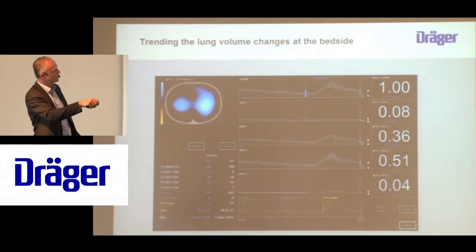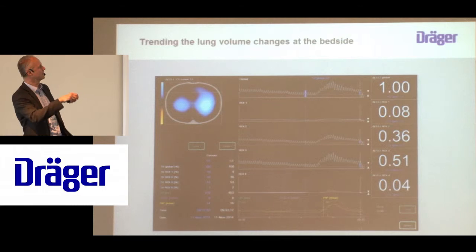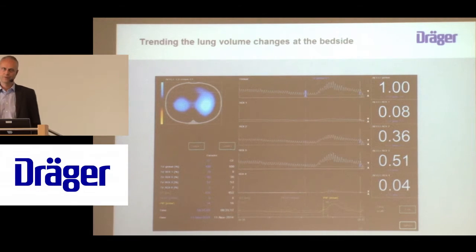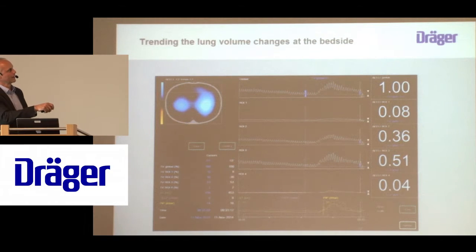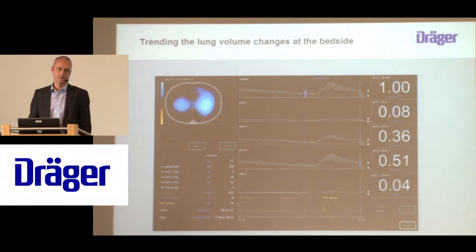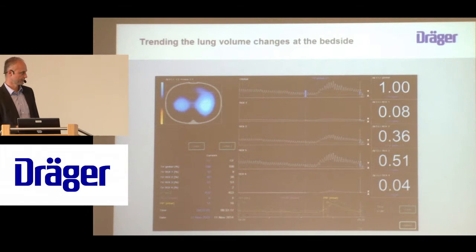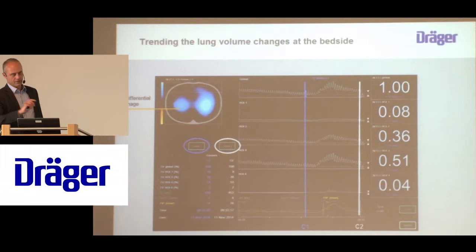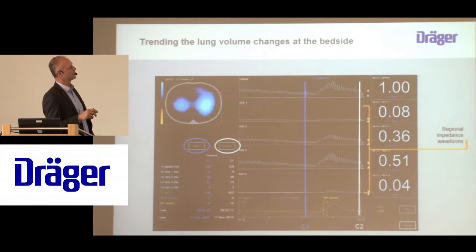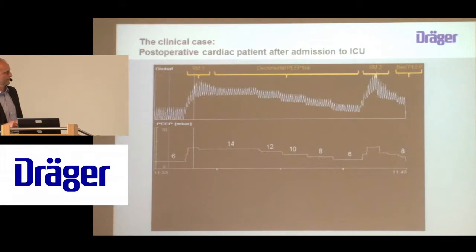In this case, we would get one displayed in this dedicated view, which is just focusing on lung volume changes of the end expiratory lung volume. And then this would mean this recruitment maneuver has led to an increase of FRC of about 400 mLs. And then the way of comparing the cursors with each other is the same as in the other trend view.